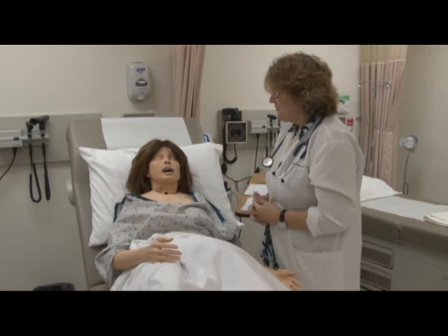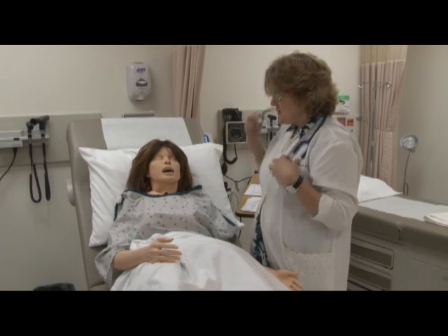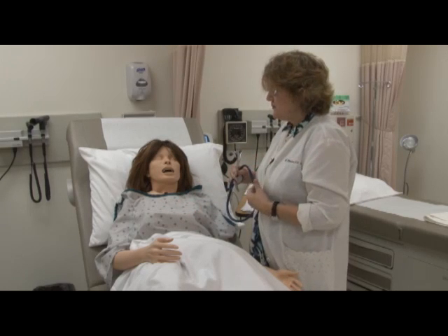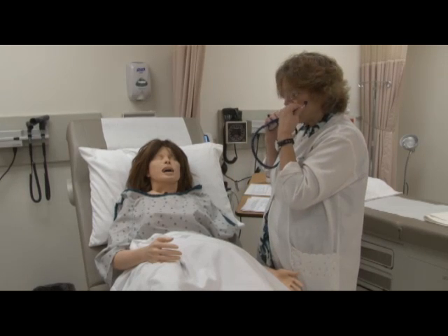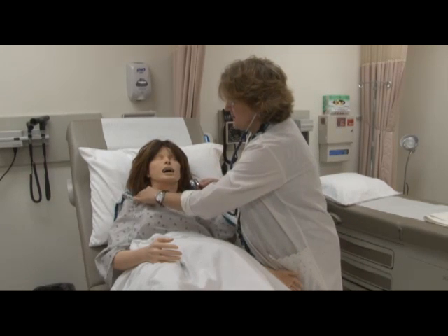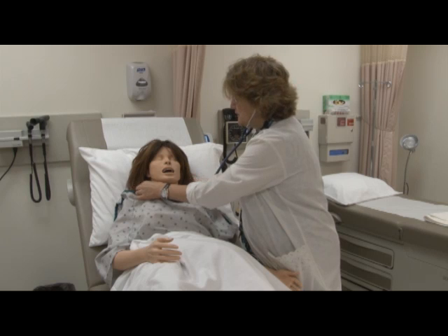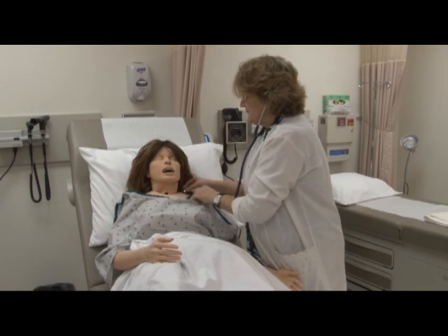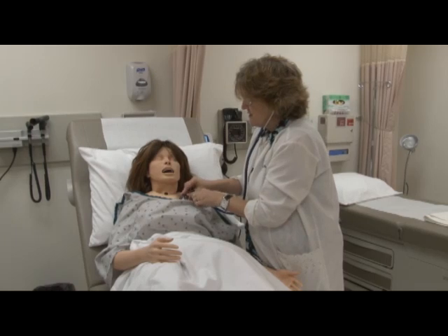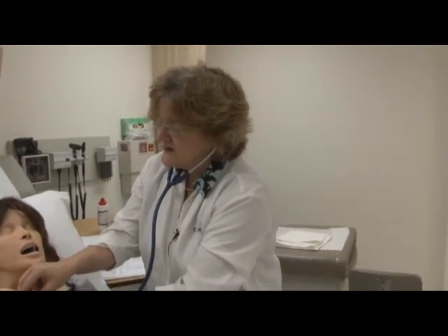Now we're ready, Ms. Jones, to listen to your lungs. Please take a deep breath in and out every time I place my stethoscope. I'll be doing eight spots on the front of your chest and then more on the back. I'm going to start above the clavicle because there's lung tissue there, then go across to compare sides, coming down to about the second intercostal space.